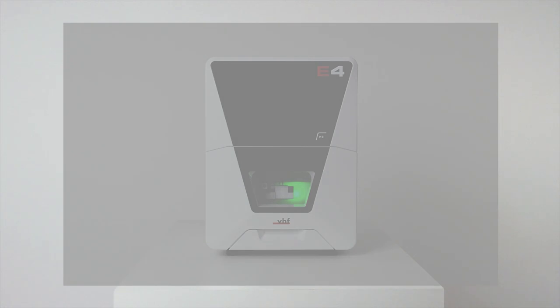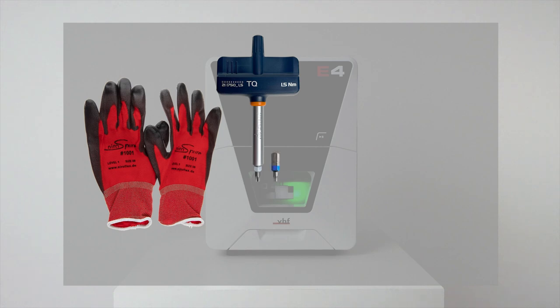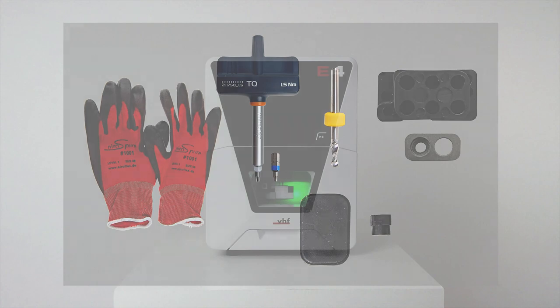Have the following items ready: protective gloves, the provided 1.5 Newton meters torque screwdriver with the TX 20 and TX 10 bit. If you want to exchange the tool magazine inserts, have the two spare inserts and the dedicated 2.8 millimeters drilling tool ready. If you want to exchange at least one of the holders, have the spare holder for the standard tool magazine insert or the spare holder for the air tool insert ready as required.